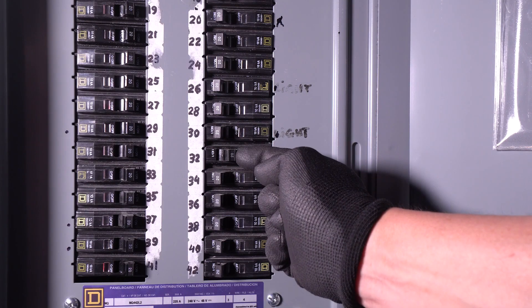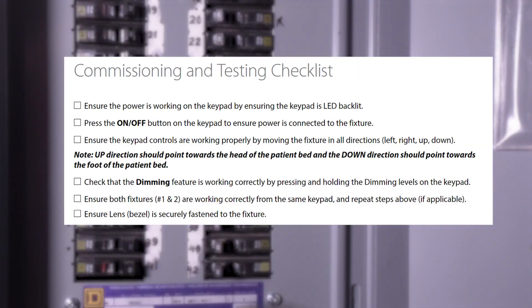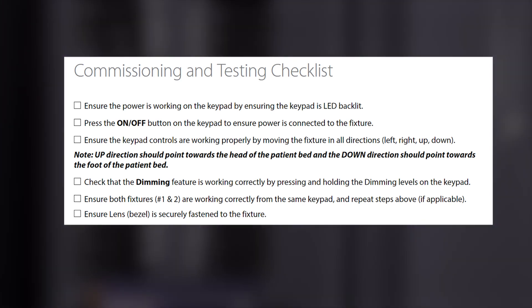You may now turn the electrical breaker on and test the fixture to make sure it is functioning properly. Please refer to the commissioning and testing checklist in the manual. Your NOVA motorized exam light is now installed and ready to use.